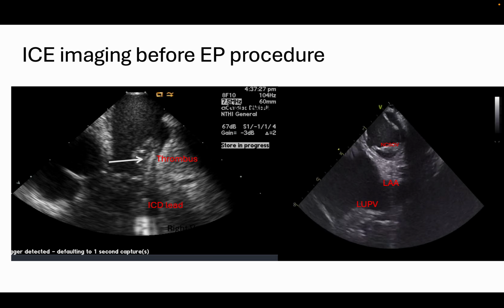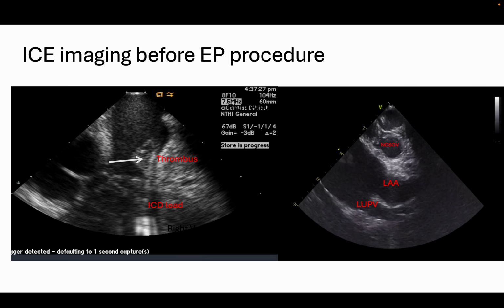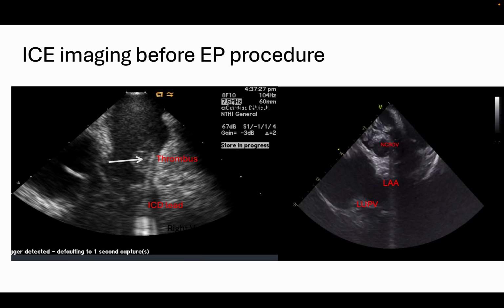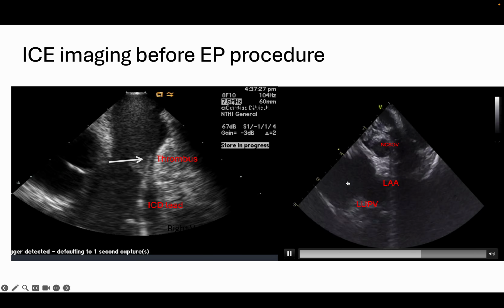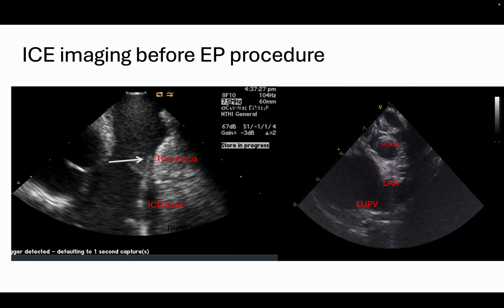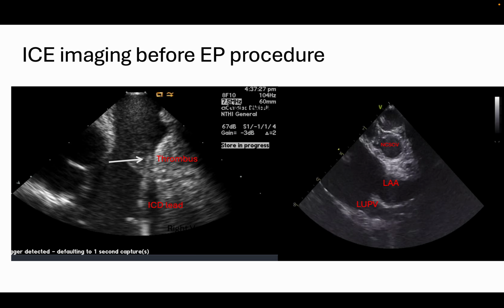Similarly, if we are able to flex and enter the ventricle in an anterior location and then clock it, we can see the aorta in cross section along with the left atrial appendage and the left upper pulmonary vein. This is also a very useful view, especially when using older catheters where the fidelity of the catheter in the image may not be very good.